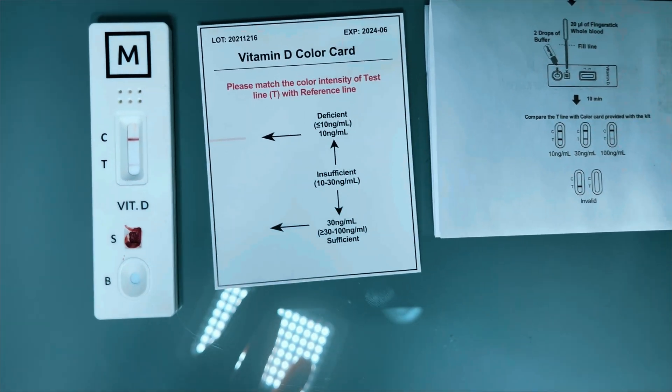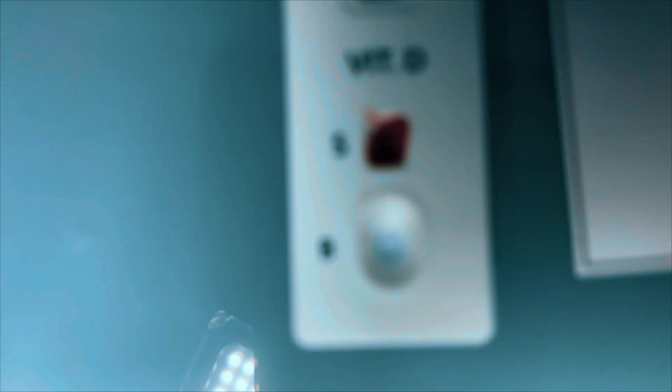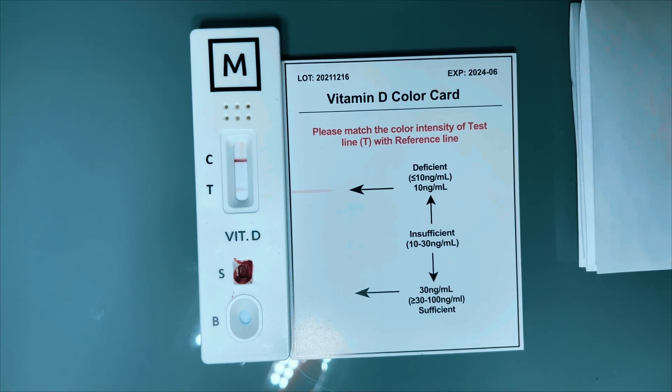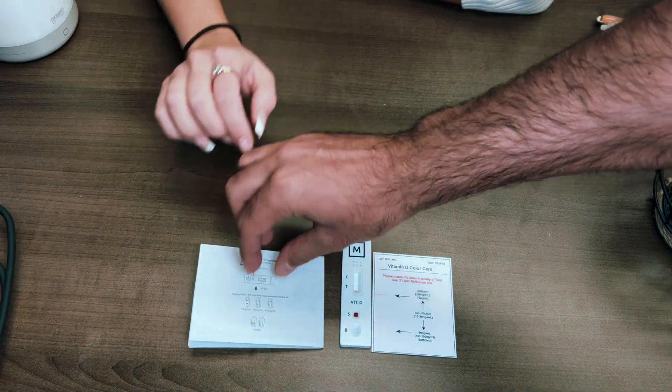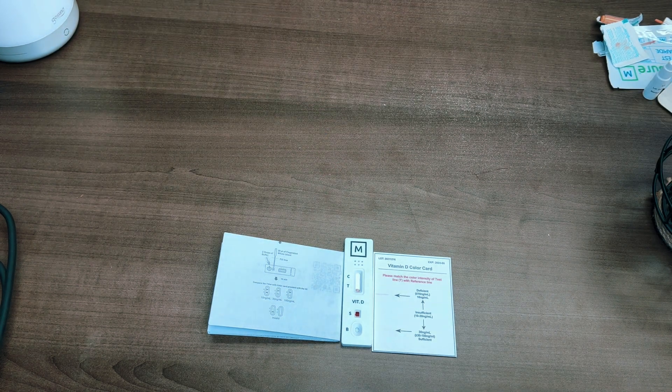This test will only tell you if you're sufficient, deficient, or insufficient — it won't tell you if your Vitamin D levels are too high. But it's still helpful because you'll know if you need supplementation. For me, I was definitely deficient; I've been deficient in the past, I take Vitamin D on and off, and living in Canada indoors all day means I don't get enough sunlight.